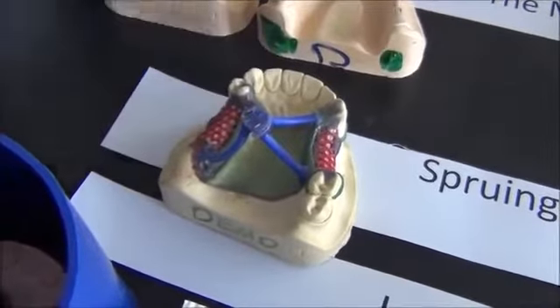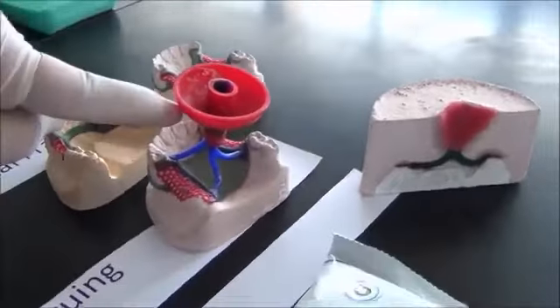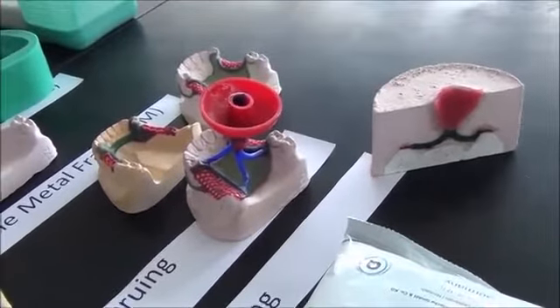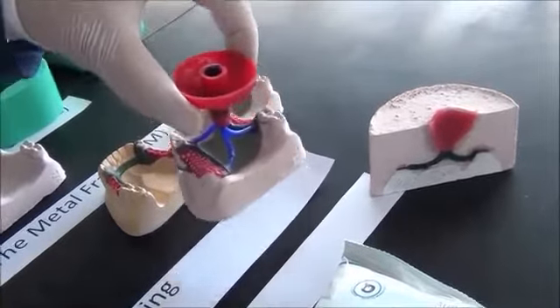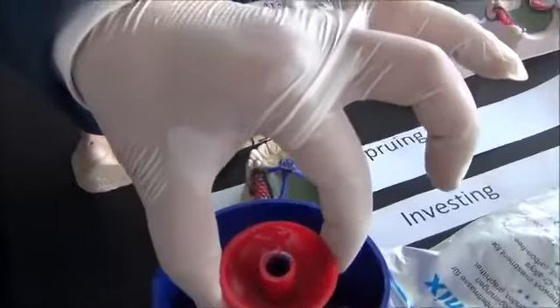These sprues later on will be attached to a funnel. These are extra components essential for the casting process. This finished wax up with the spruing and the funnel is placed in what we call an investment ring.